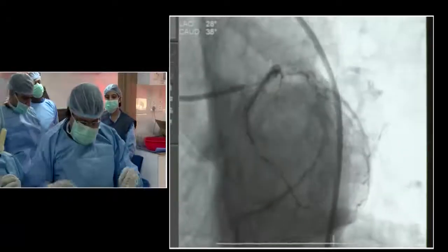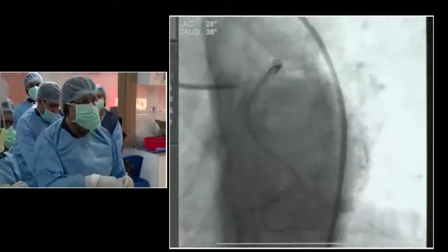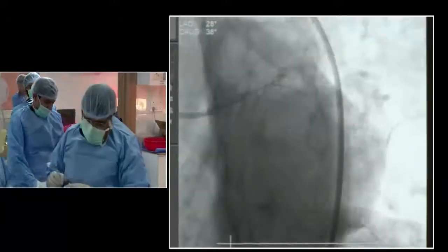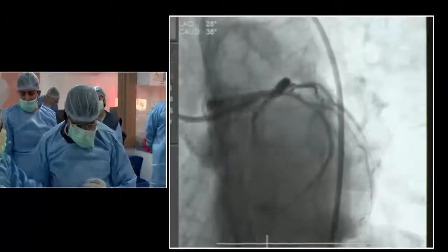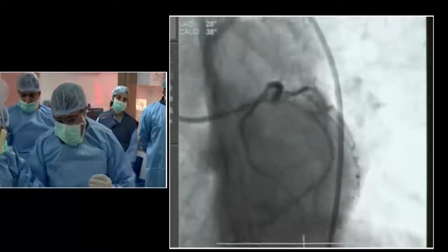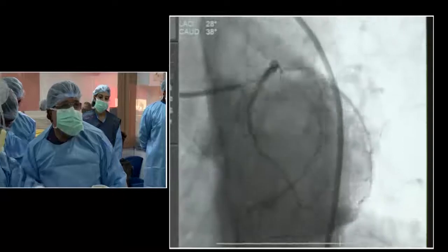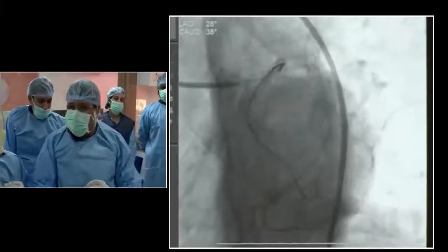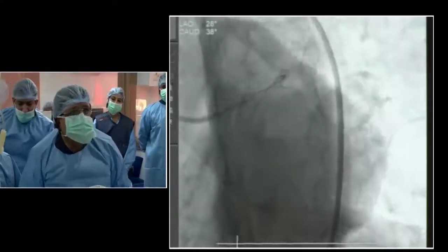Okay, is that okay with the house? Yes, ready. Stent first. How many 4, how many 3.5? Okay, then give me a Synergy 312. In your left main, the stent has to be around 4.5. And 3.5 millimeter stents can easily be blown up, yes you can blow, but the covering area will be less. Metal covering area will be less. The space between the holes will increase.